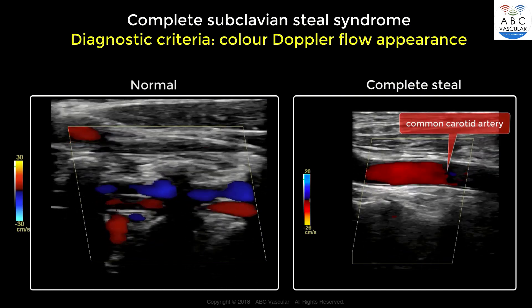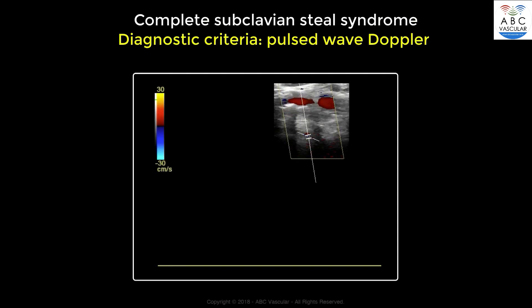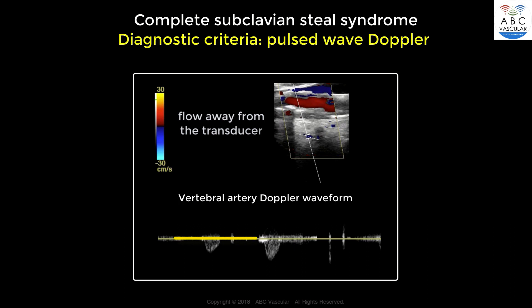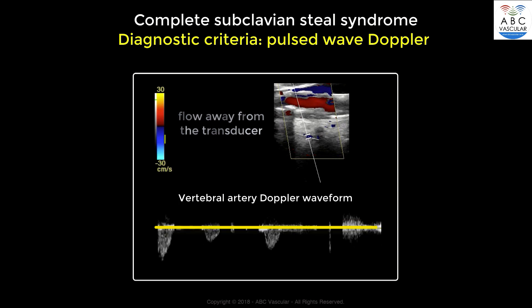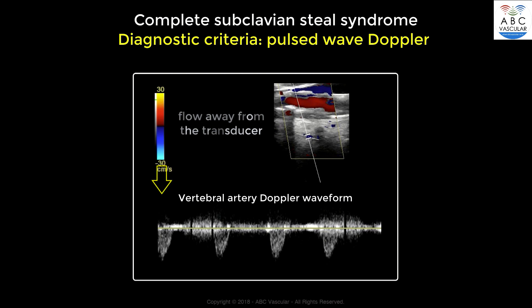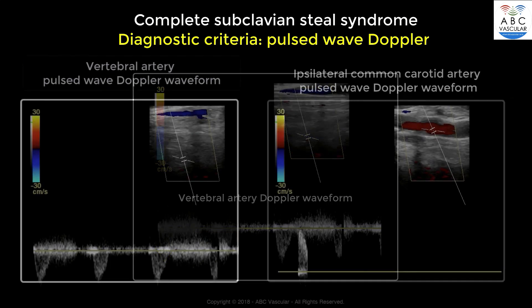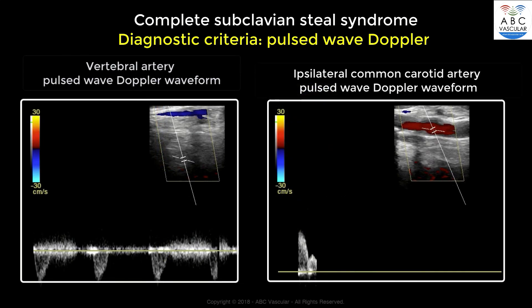A second criterion used to confirm the presence of a complete steal of the flow through the vertebral artery is the Doppler waveform. Simply obtain a Doppler waveform from the vertebral artery and observe the direction of the flow. In this example, the vertebral artery Doppler waveform is below the baseline, indicating that the flow is directed away from the transducer. This criterion is used to confirm the color Doppler flow findings.